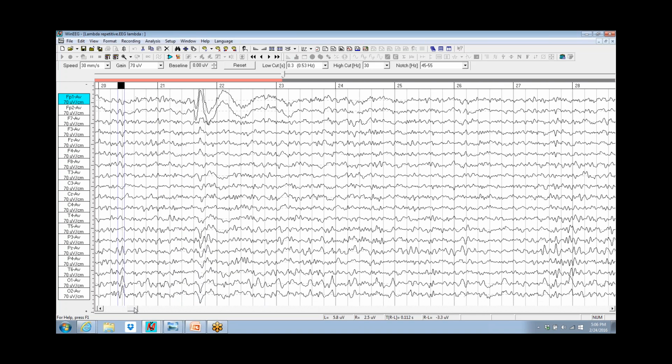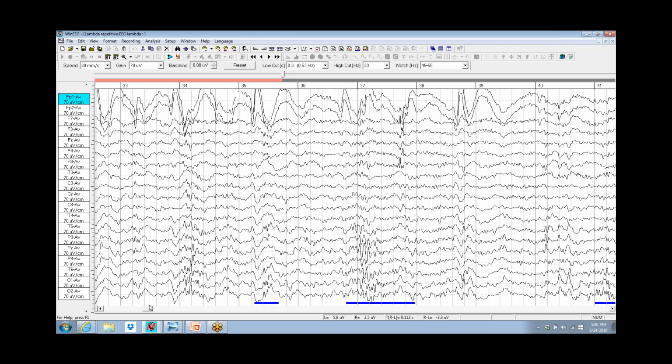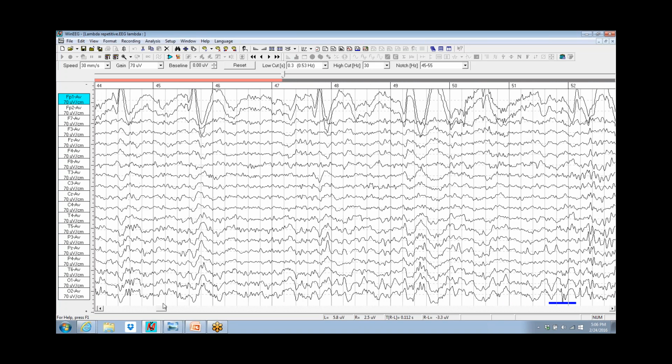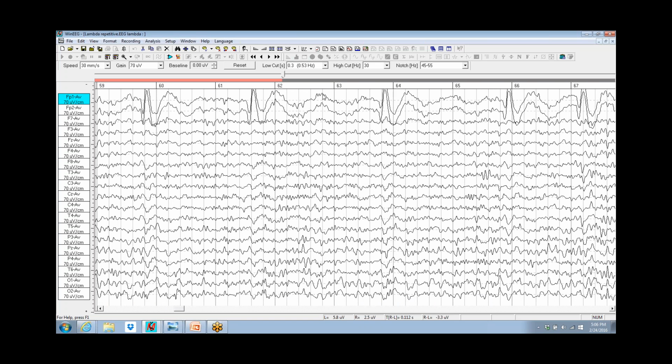So the EEG is essentially full of ERPs, but we don't see them as event-related potentials because they're small and they're not averaged up. In order to see the small potentials, we've got to get rid of the background EEG. Now, if we pick any point in time, the EEG may be going up or down. If we picked small segments and averaged them, sometimes the EEG was going up and sometimes it was going down.